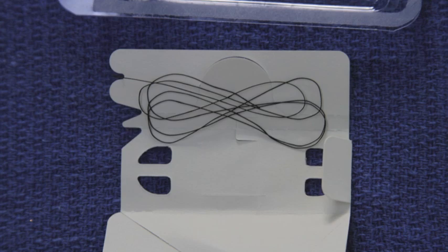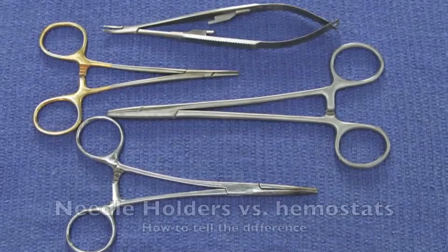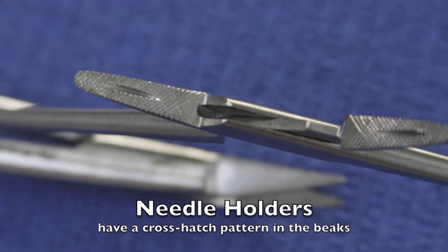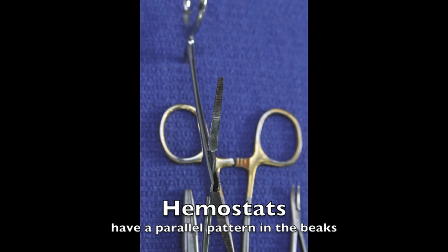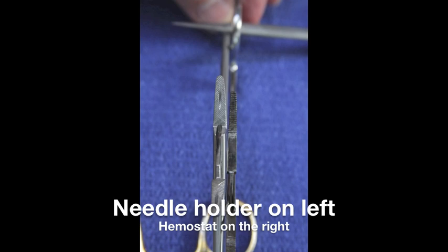One thing to be mindful of is as you choose your instrumentation, make sure that you're actually holding onto a needle holder and not onto a hemostat. The basic difference is a needle holder is used exclusively to hold suture needles. The hemostat, on the other hand, is used to pinch or to close off blood vessels during a surgical procedure so as to minimize blood flow. They look the same, but they are fundamentally different in their design. Both are similar in that they have finger rings, they have beaks, they have hinges. The difference, though, is found in the beaks themselves.